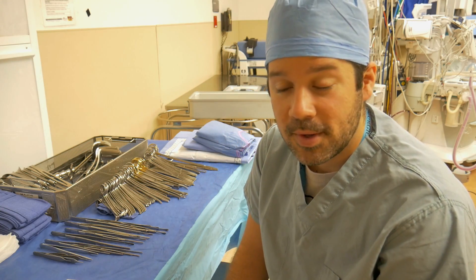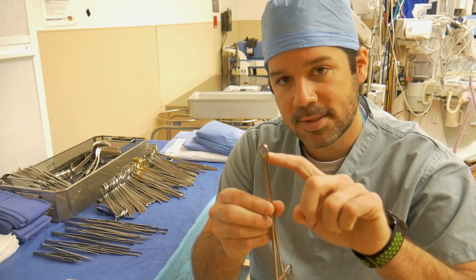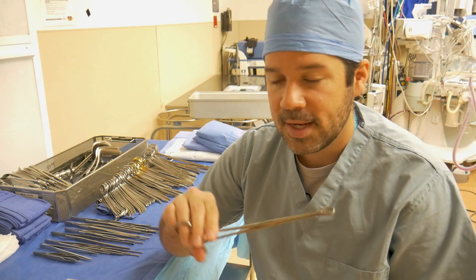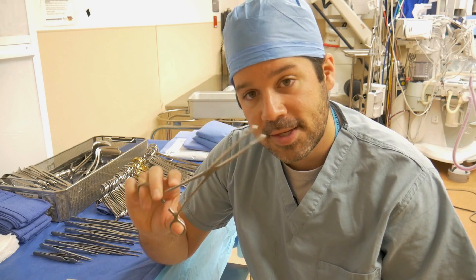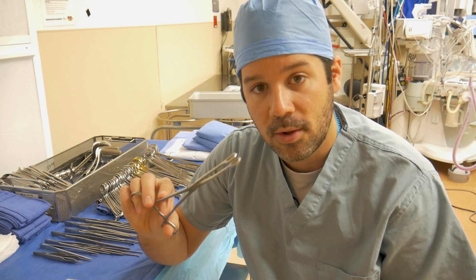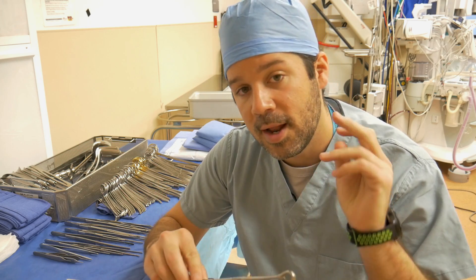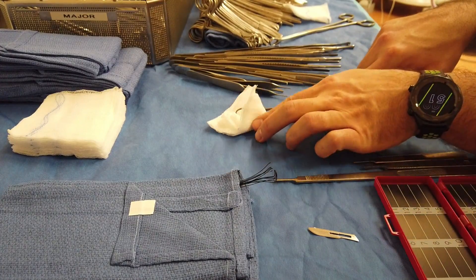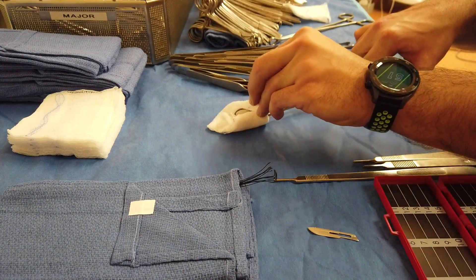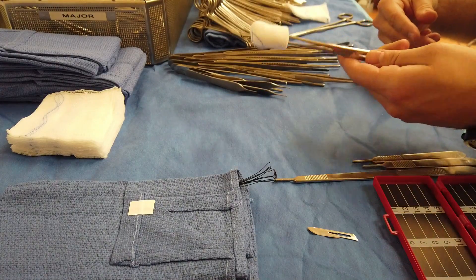One of the first surgical skills I want to go over is creating a sponge stick. This is our sponge stick instrument — it's got this nice little ring on it. When surgeons ask for a sponge forcep, they want this without a sponge attached. When they ask for a sponge stick, they want a sponge wrapped around it. The first way to make a sponge stick is the diaper wrap, which gives it a 360-degree wrapping around the entire forcep.